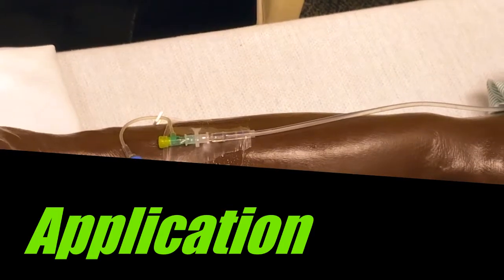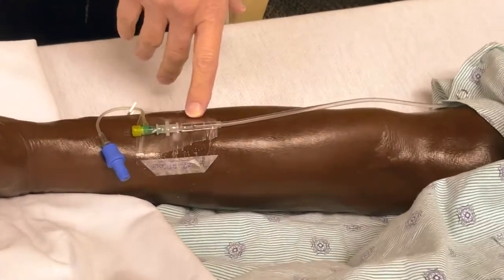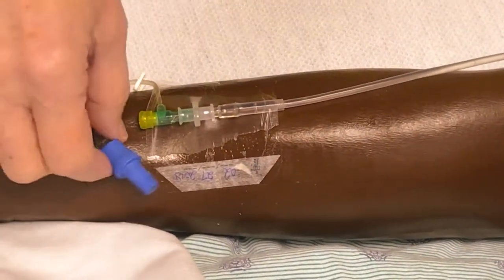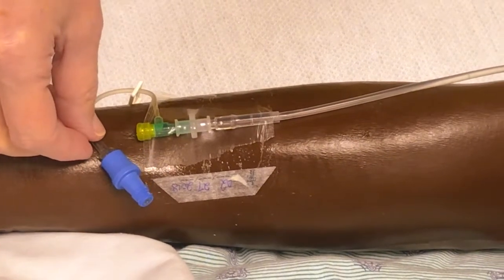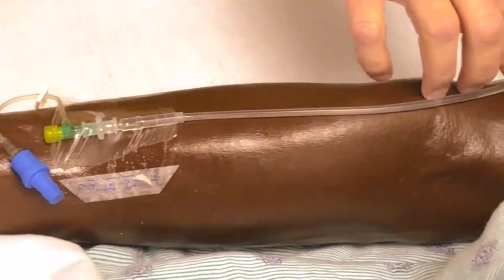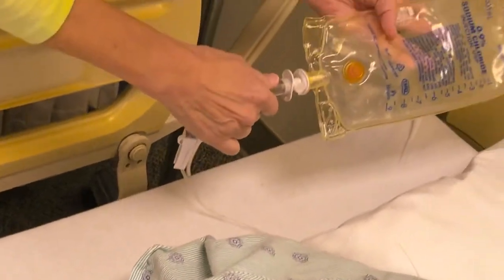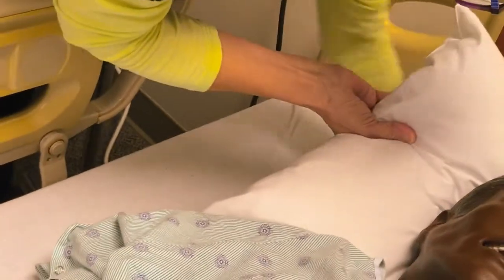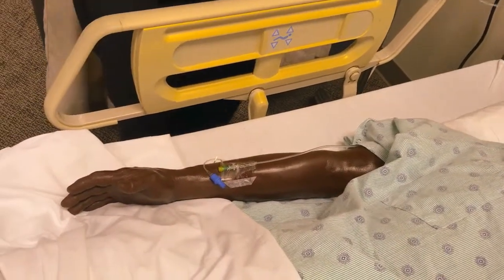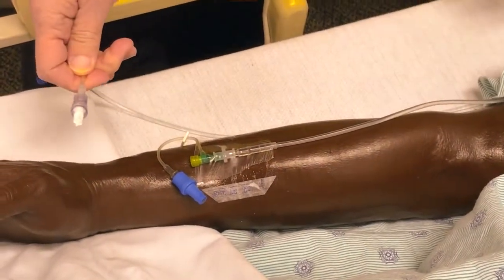Here you see the simulated IV bypass system placed on a mannequin. You choose a site that is appropriate for IV insertion and secure the apparatus with your Tegaderm dressing. You may want to use additional tape to secure the IV, similar to what you would do with a real patient. The drainage tubing then just goes up the patient arm and we feed it through the patient gown here, and then obviously to the collection bag, which can be hidden underneath the patient's pillow. The system is now ready for use. Students can attach IV fluids or administer IV medications depending on your objectives.